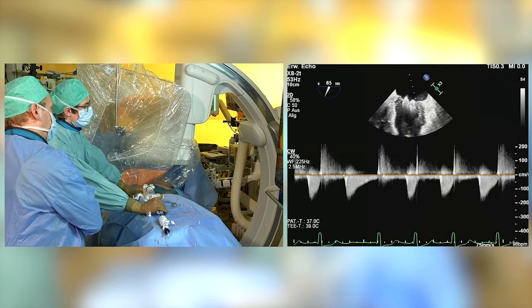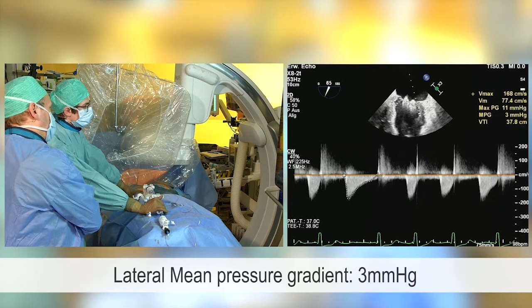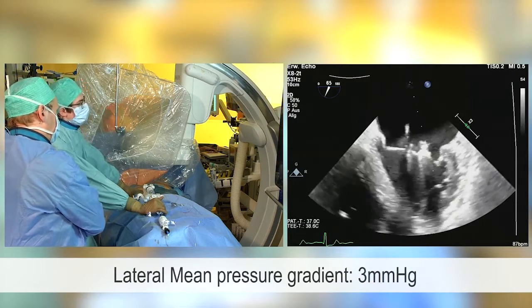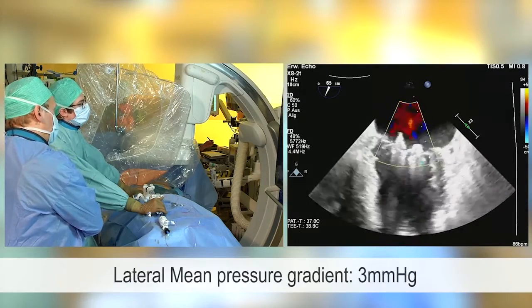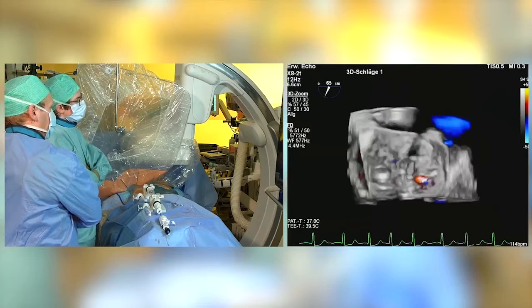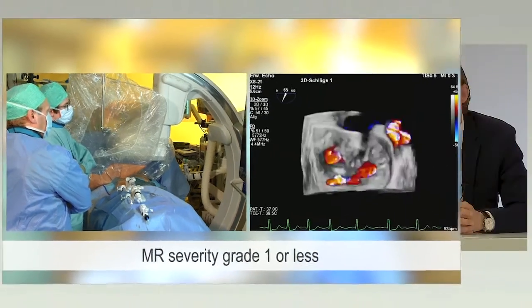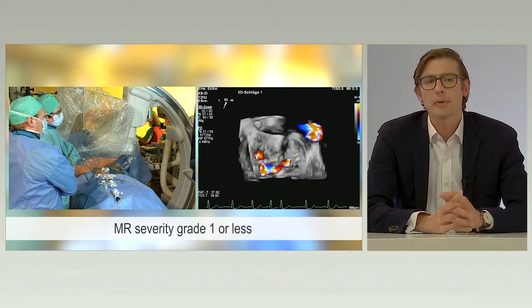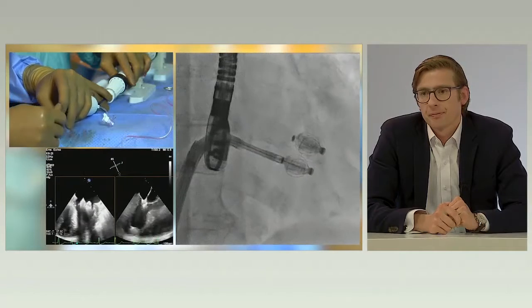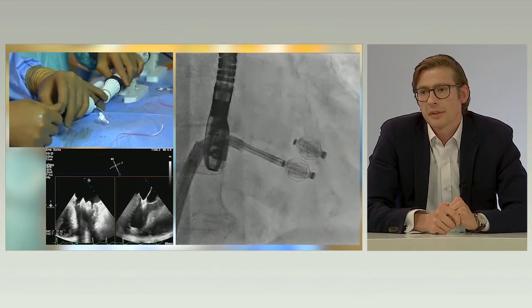We double check that at different orifices. You really want to make sure that you don't underestimate it. So we had 4 first, here we have 3 millimeters of mercury, which is really interesting that in a valve which is not terribly large, the two devices can be implanted to reduce MR at the same time ending up with a gradient of 3 millimeters of mercury. And in terms of MR reduction, we were happy, but remember the device is still connected to the delivery system. So next step is release of the device.